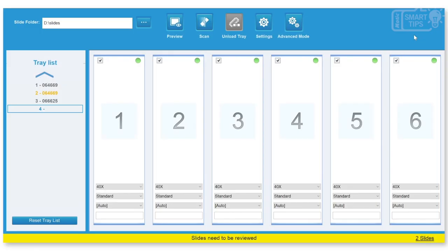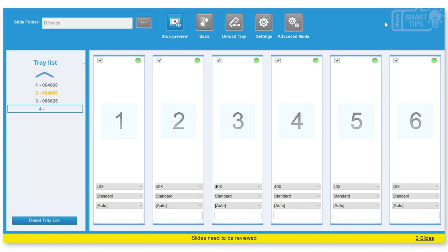We have already scanned the slides, I will show you in a moment. But first, before that, I want you to see a different feature and that is the preview. This takes a little while.